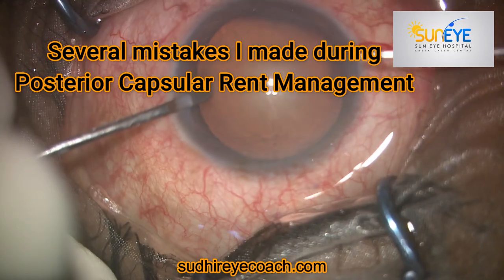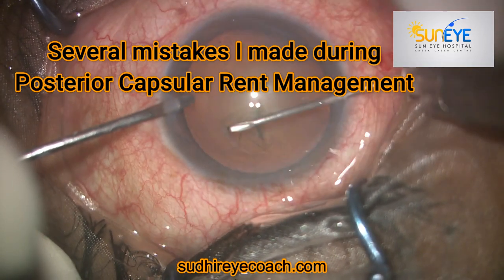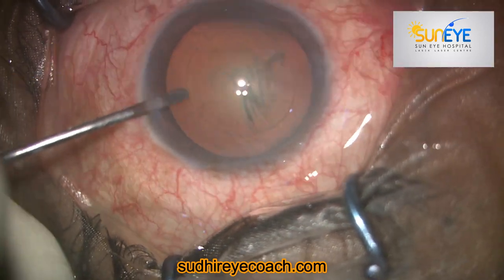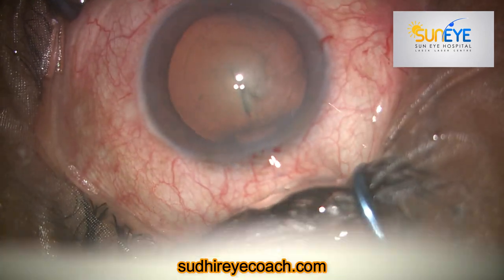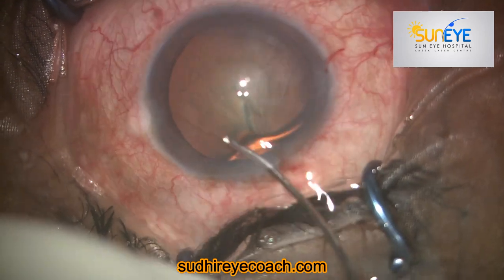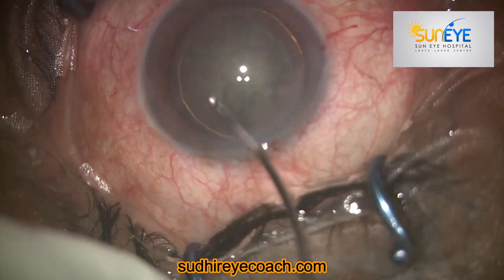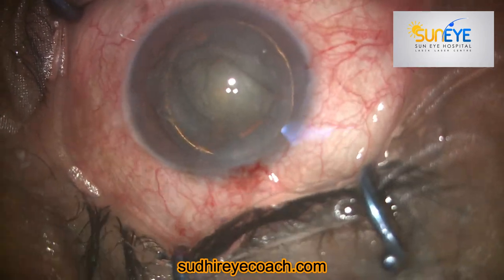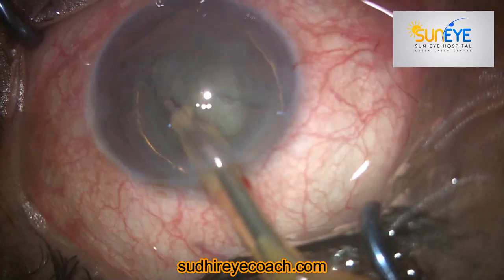This was a routine case and I started as routine. I made a good decent size capsule rexis of around 5.1 to 5.5 millimeters, then I did good hydrodissection and delineation, just to separate the nucleus, the epinucleus plate, and the cortical matter from the capsule.